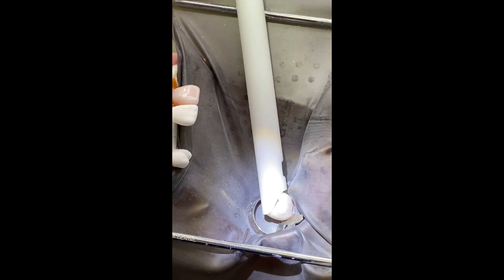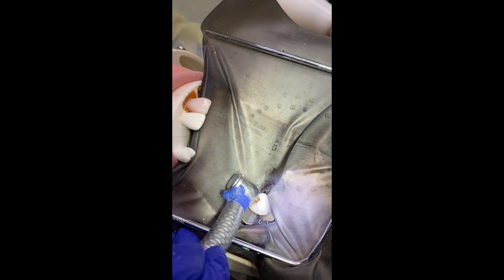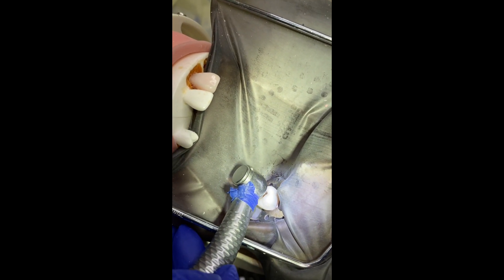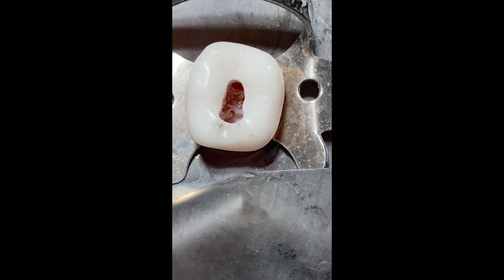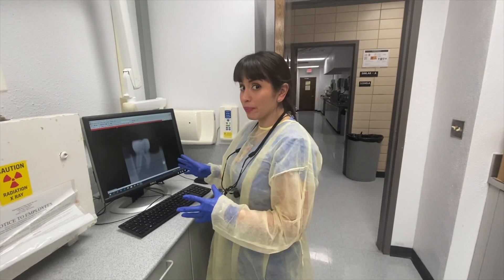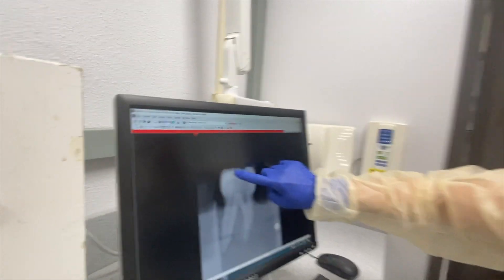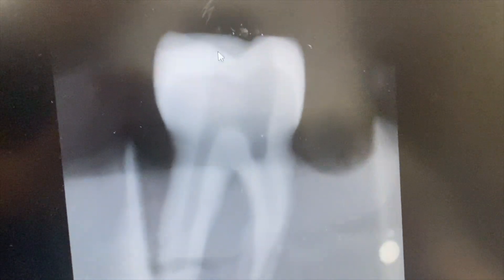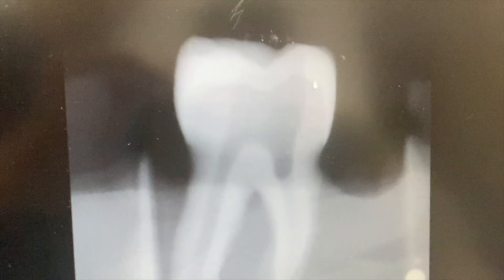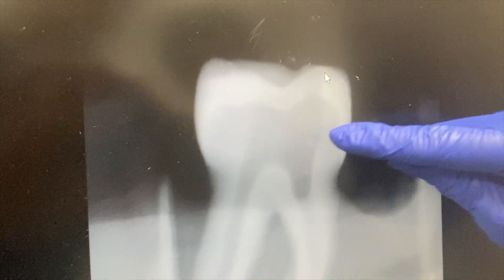In addition to excavation, you can also use irrigation to clear the canal, and you can use a cotton pellet to dry up the canal. Here I am using the endo Z burr up to the hub to remove the ledge. This is our post-op x-ray. On the distal we got perfect straight-line access — you can see right here a complete straight line. On the mesial canal, we can see that we're a little bit angled, there is a little bit of a lump right here, and then we come into the canal with a curve.